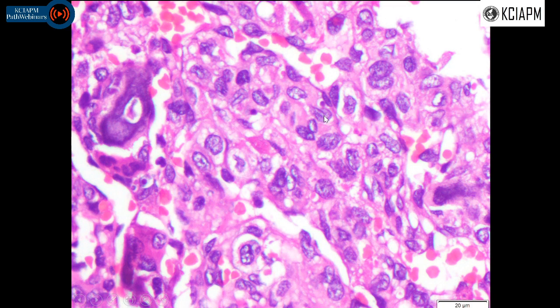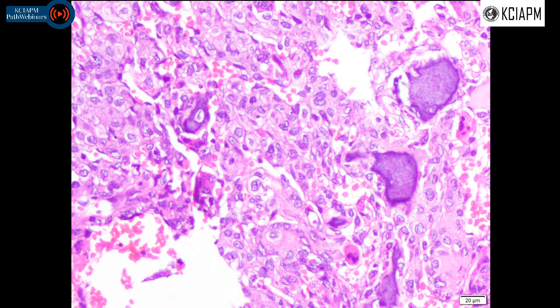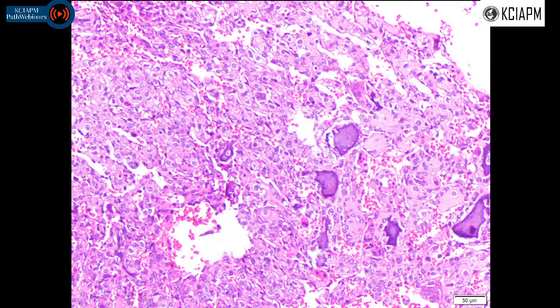In this area there's one more here, there's one more, there's one more. So we have a chondroblastoma, we have a component of an ABC, but it is not a giant cell tumor. And the osteoclasts are part of the ABC, which seem to be lining these spaces and having this giant cell component.